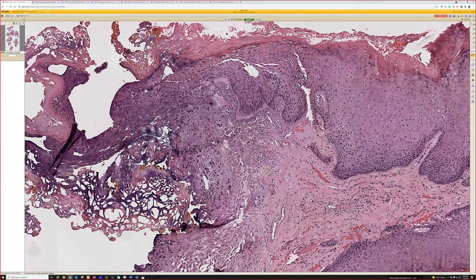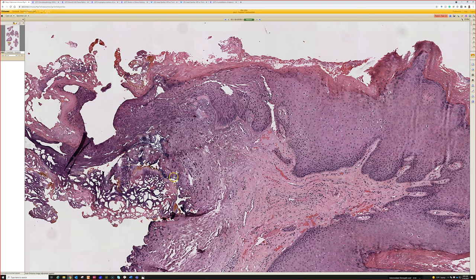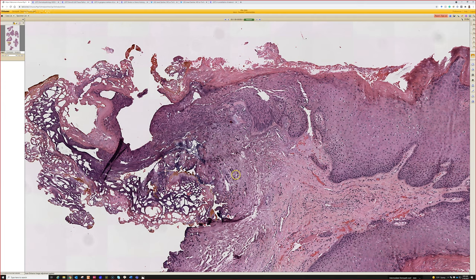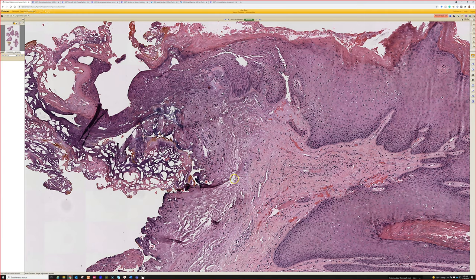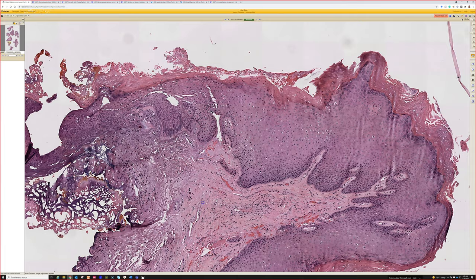In dermatology training you may not encounter this very often, because most dermatologists I've worked with do not remove skin specimens with electrosurgery. In the practice settings I've been in, when I see cautery, I know almost certainly it was taken off by a surgeon or somebody non-dermatologist. Once it gets cauterized, I cannot tell what's happening there. If you want me to give you margins and you have tumor cells going into a cauterized area, I'm going to call the margin positive because I cannot reliably see what's actually happening at the ink. So condyloma plus cautery artifact.